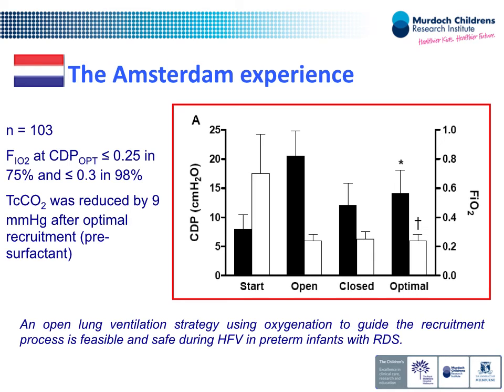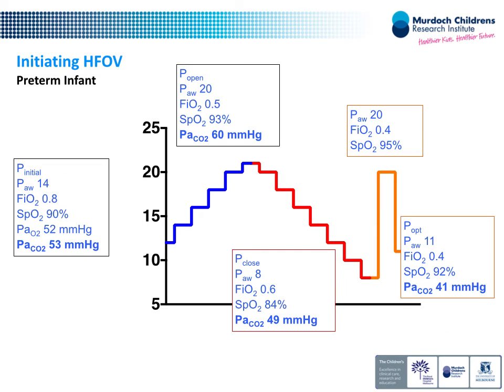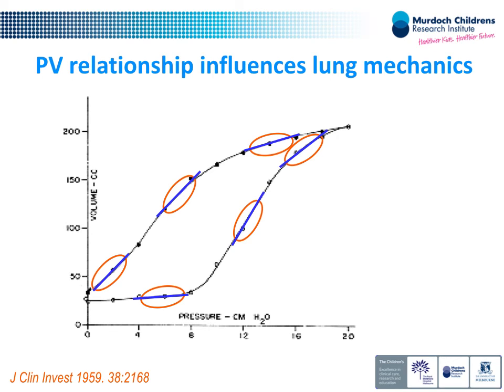So again, it's not that I must come and do this every 4 to 6 hours or every 12 hours or whatever. It's got to be guided by the disease and the baby. And that's somewhat biased by the fact that we run a lot of different lung diseases in our units. We see different things. But it's also a mental thing. People don't like to change if the numbers are right. It took a lot of effort in our unit to say, well, maybe your mean airway pressure of 12 and 25% oxygen.